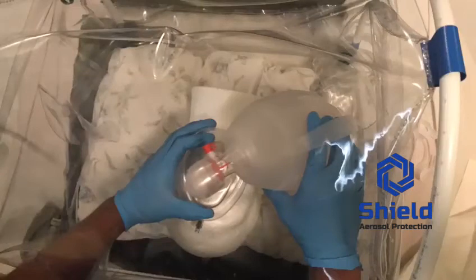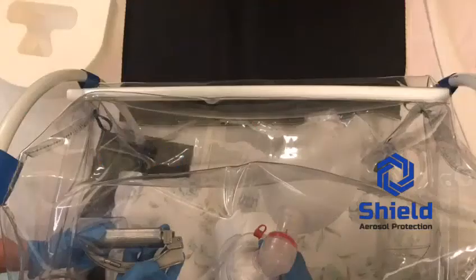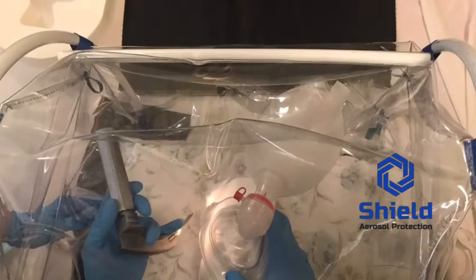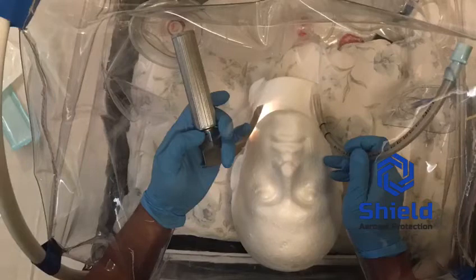In this series of stills, the mannequin is being pre-oxygenated as in the normal situation. On completion of pre-oxygenation and the patient being ready to intubate, the ODP passes the laryngoscope through a side flap which the anaesthetist accepts. The ODP then proceeds to provide an endotracheal tube through the other flap on the other side, which the anaesthetist accepts as well, and gets ready and positions himself or herself to intubate.